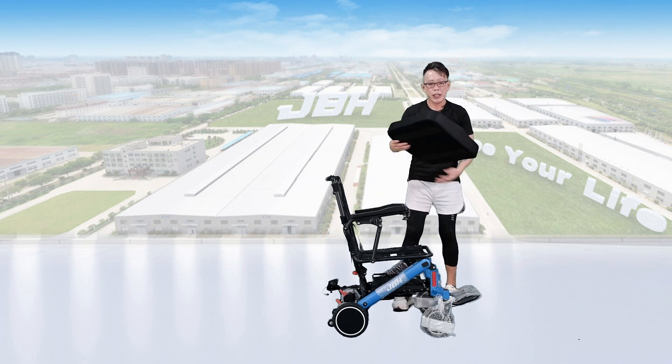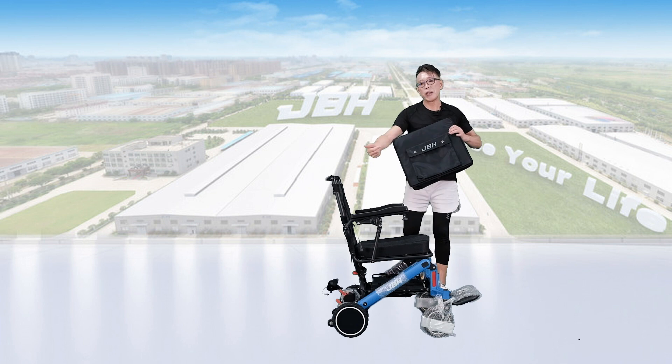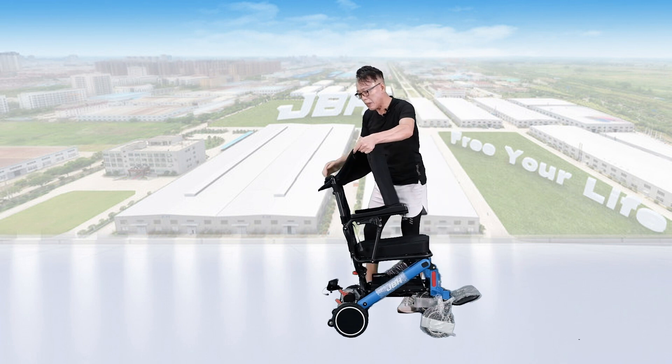We set up the seat cushion on the top of the seat. The seat back cushion goes with the logo to the back — insert it right in between the space here.